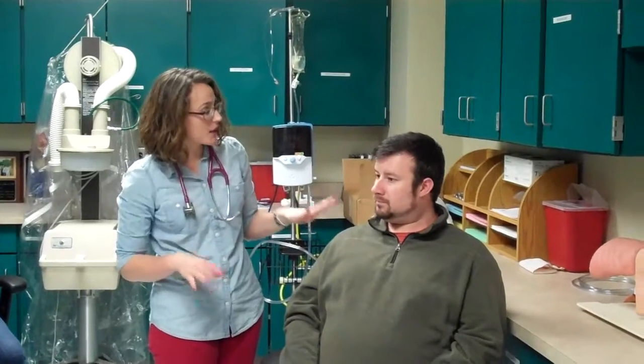Alright, and I checked your breath sounds. You just got more wheezing going, which is good. That means we're opening up those airways. You don't have as many crackles, so you probably coughed some of that up whenever you cough. That's excellent. That's definitely what we want to hear.